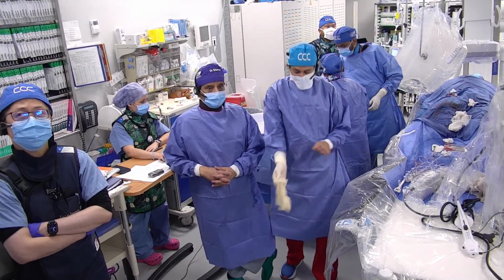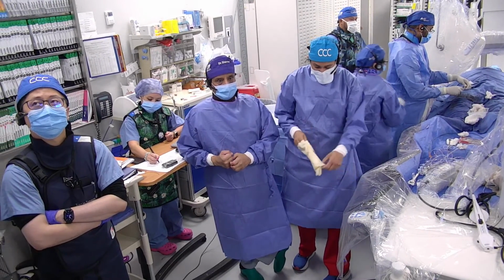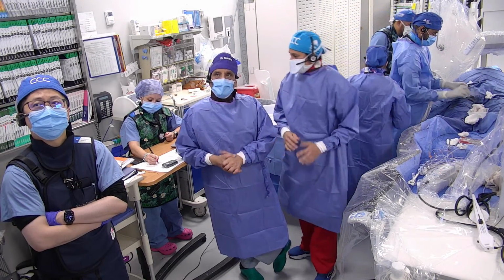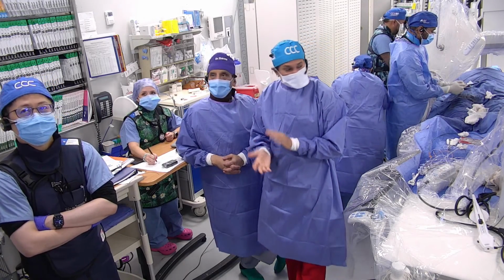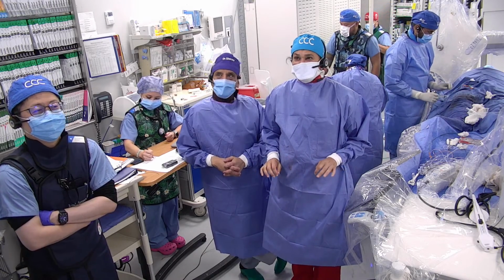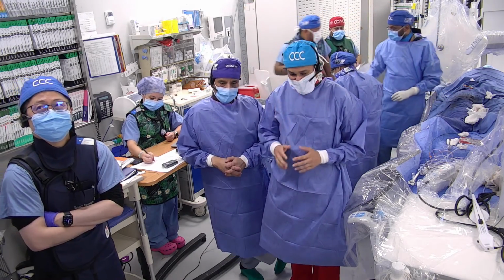I'm not a fan of touching any part of the vessel that does not need it. That is called a Sharma Colombo massage. Colombo does it and I do it. With the same balloon, go distally, leave it at 2 atmospheres for about 30 seconds and take it out.